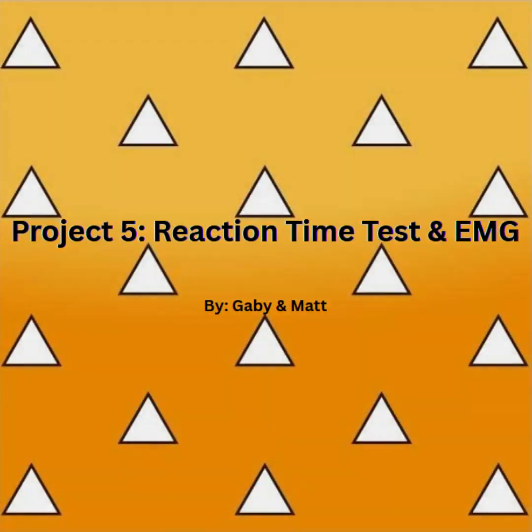Project 5 was to connect two ESP32 to one phone. One ESP32 would have our reaction and motion time test. For this ESP32, we would test reaction time by flashing an image on screen and have the user tap the image as fast as possible. Their reaction time would be displayed on screen.